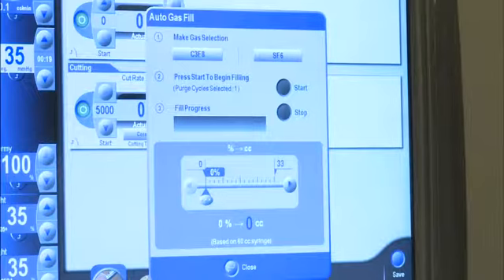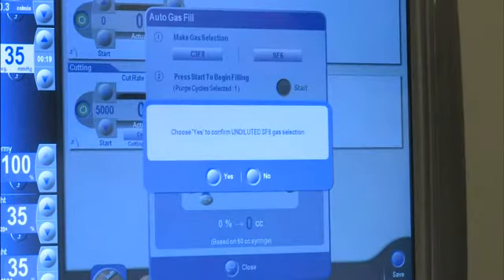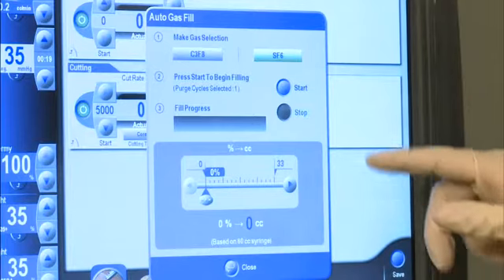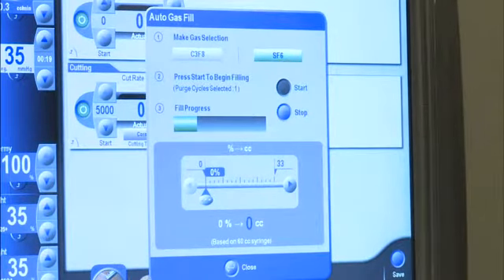On the Auto Gas Fill control screen, select the type of gas to be used for the procedure. You will be asked to confirm the gas selection. Press the Start button to initiate the filling process. The console will perform the purge and fill cycles automatically based on the user-defined setting.